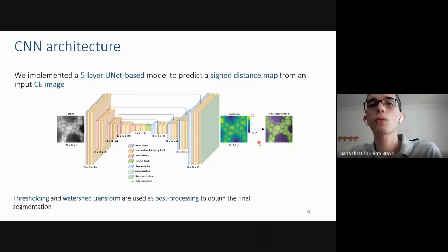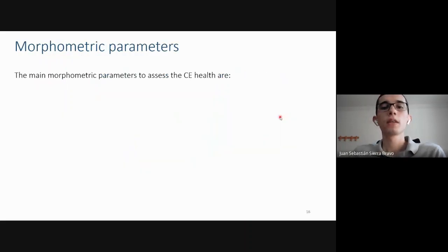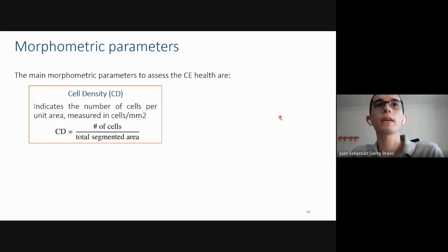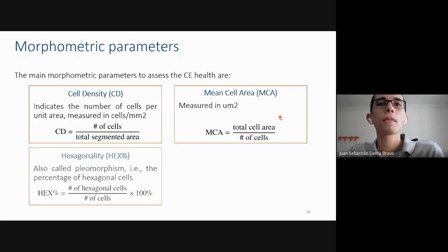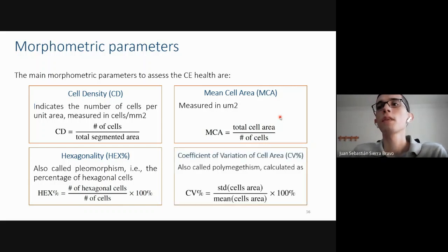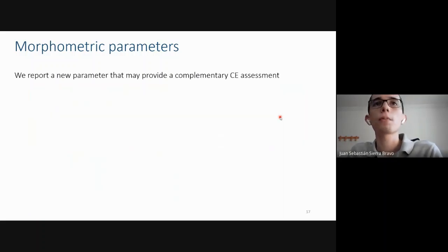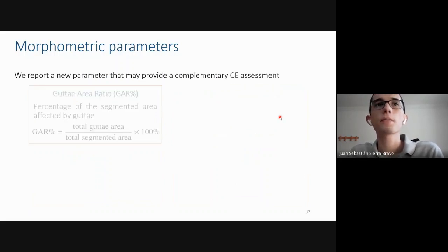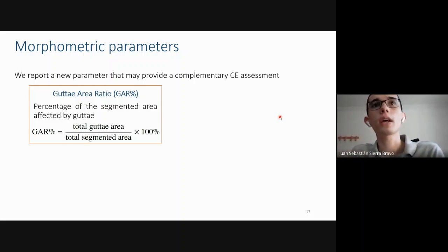Thresholding and watershed transform are used as post-processing to obtain the final segmentation. Before we talk about the results, it is important to know the main morphometric parameters to assess the cornea endothelium health, which are: cell density, which indicates the number of cells per unit area; mean cell area; hexagonality, which is also called pleomorphism and represents the percentage of hexagonal cells; and the coefficient of variation of cell area, which is also called polymegethism. We also report a new parameter that may provide a complementary cornea endothelium assessment, which we call gutta area, which corresponds to the percentage of the segmented area affected by gutta.